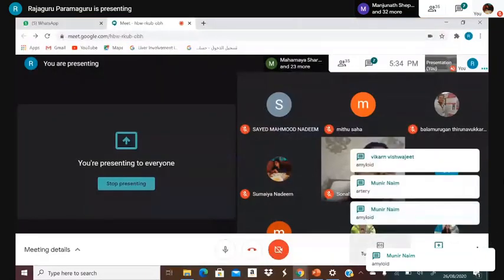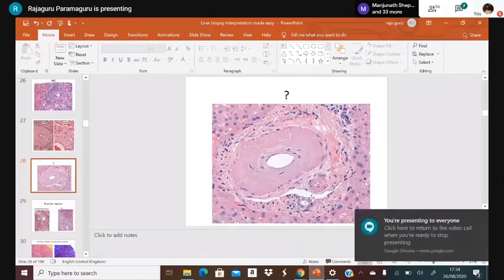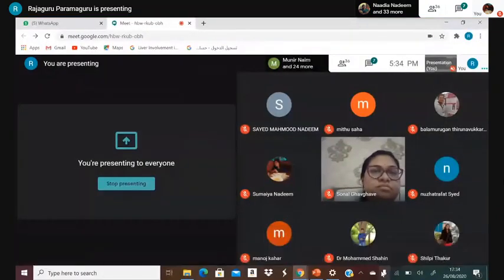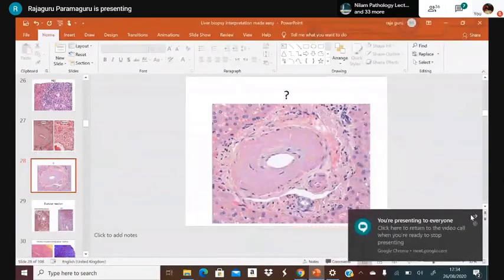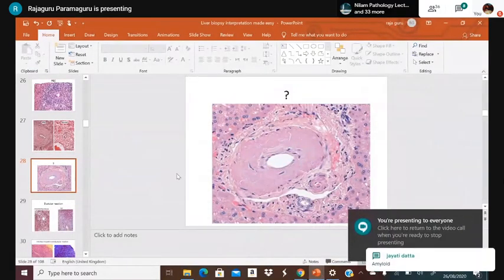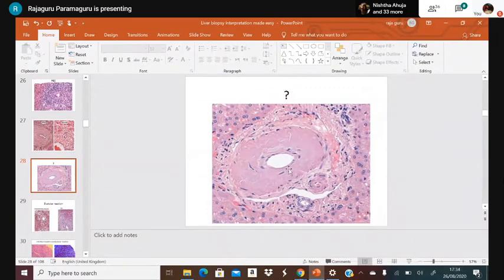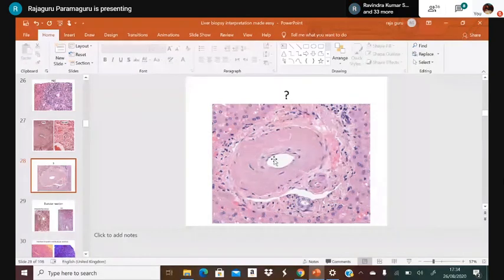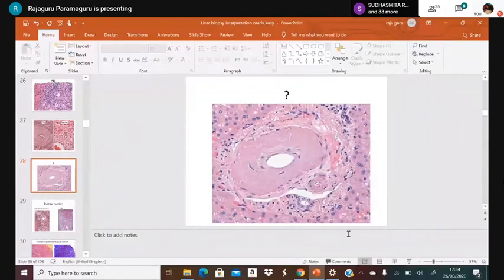This structure in the image is amyloid. Here we see the enlarged hepatic artery with amyloid deposition on the wall, and the bile duct. You should not confuse this with PBC or other biliary pathology — it is simply amyloid deposit.